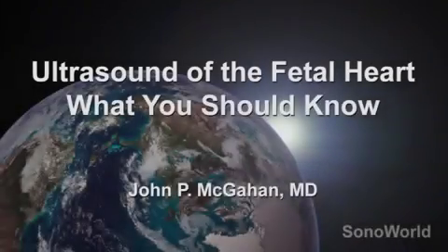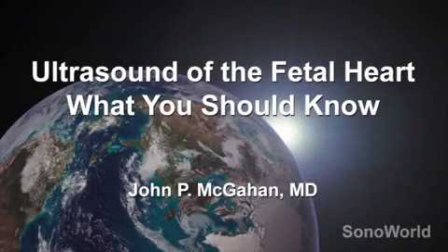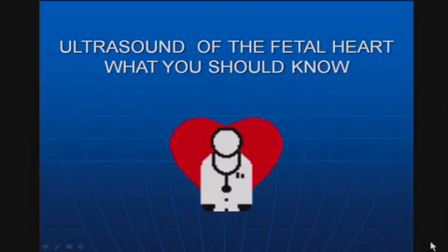I'm going to talk to you about what everybody should know about examination of the fetal heart today. What I'm going to talk about is ultrasound of the fetal heart, what everyone should know. Part of this is obviously we all want to do a better job in examination of the fetal heart so we really don't miss anything.